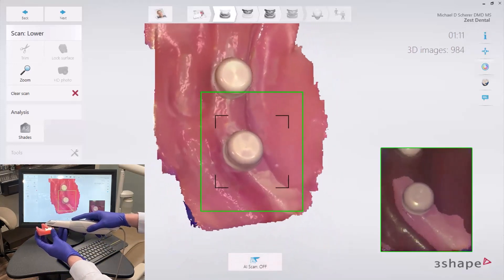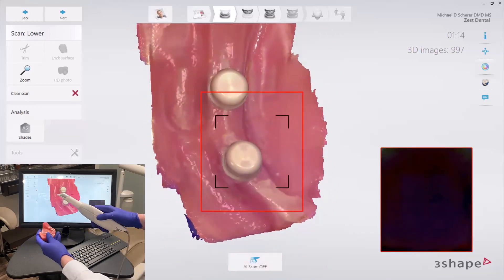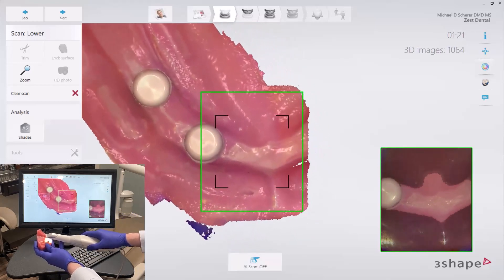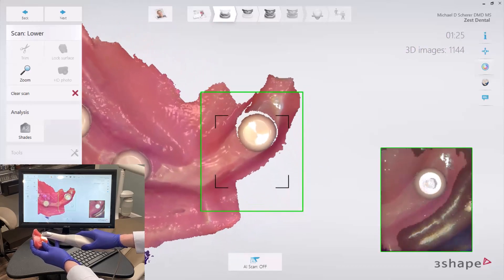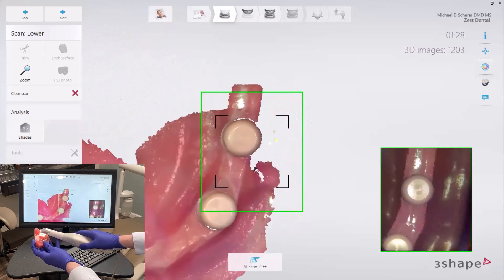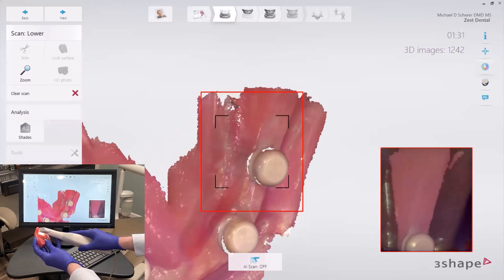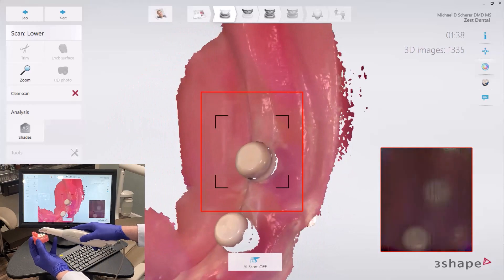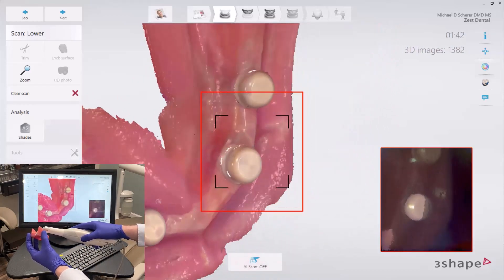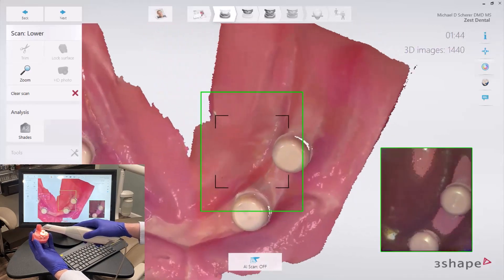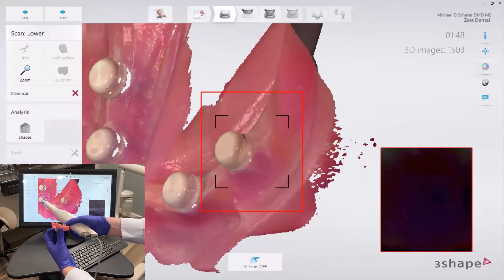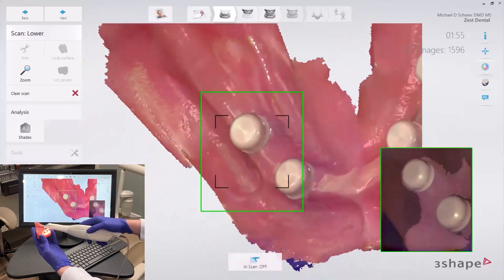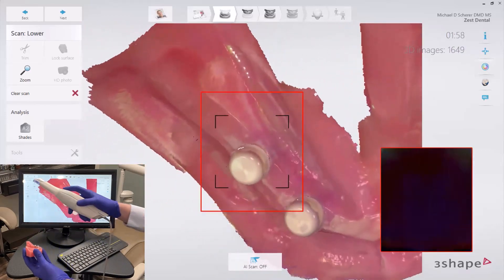As I come across to the anterior ridge, I may need to move my hands to different positions — no problem. I come back to that portion of the scan and swing across, picking up just that little edentulous ridge. Bouncing down, bouncing back. If I need to take a pause because the patient moved, no problem — I just scan those scan bodies. The enemy of good is perfection. With the locator system, you just need to get really close, pick up as much of that anatomy as possible, and bounce around to capture as much of that soft tissue as possible.